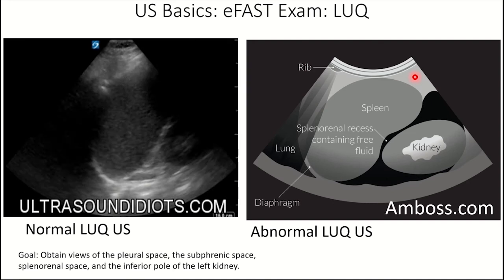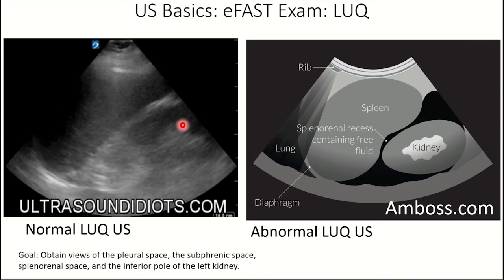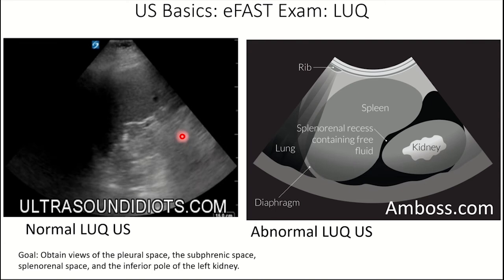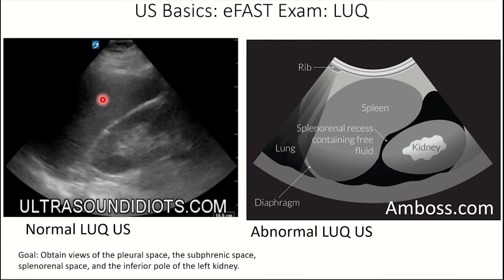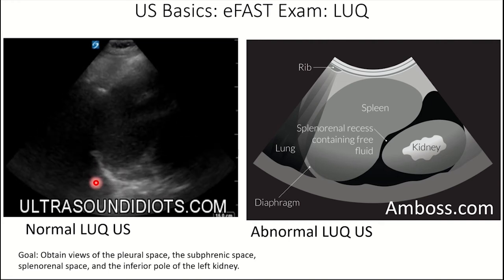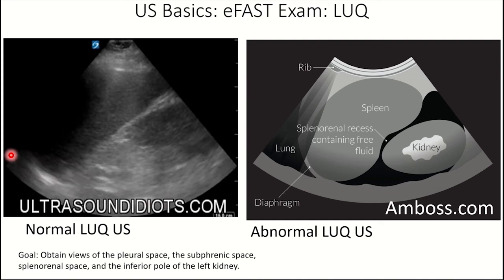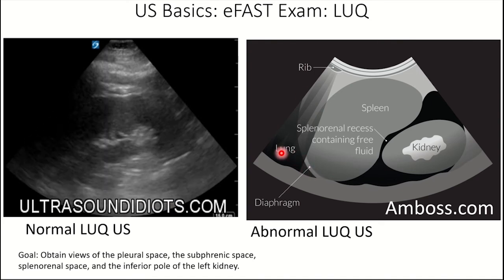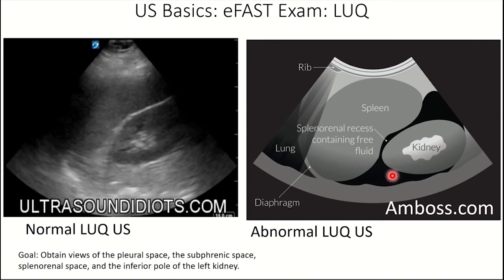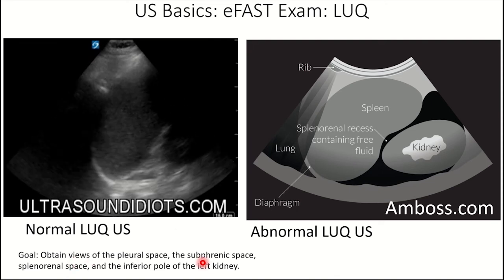Moving on to the left upper quadrant — here is a normal LUQ ultrasound. There is some rib shadowing, but we can clearly see the kidney with the white area surrounded by hypoechoic tissue. Because we're on the left side, the liver-like structure is actually the spleen — they have the same echogenicity. Looking at the edge of the spleen, we can see the white diaphragmatic stripe, and after that is the lung. When doing this ultrasound, check the pleural space, the subphrenic space, the splenorenal space, and the inferior pole of the left kidney.